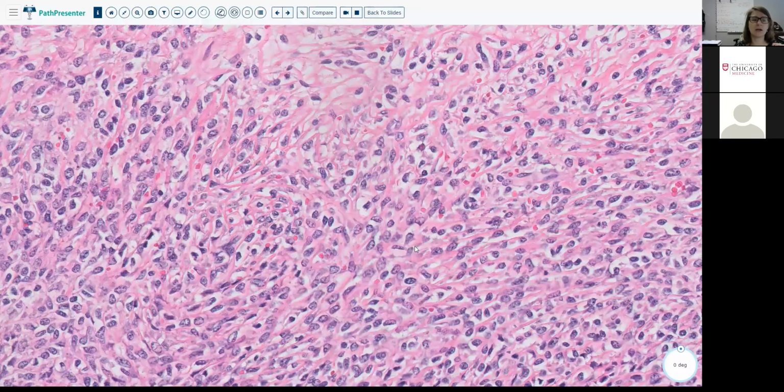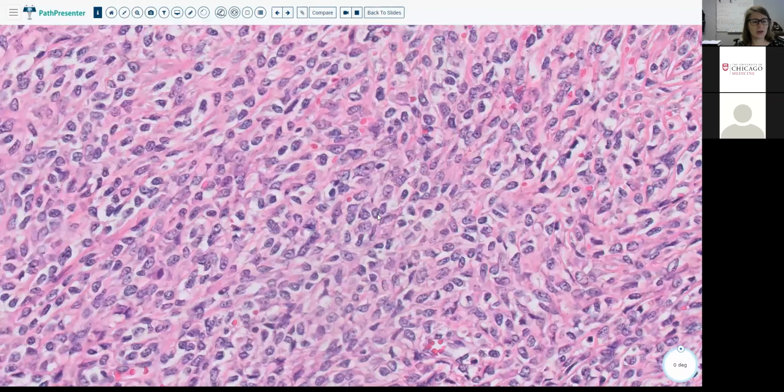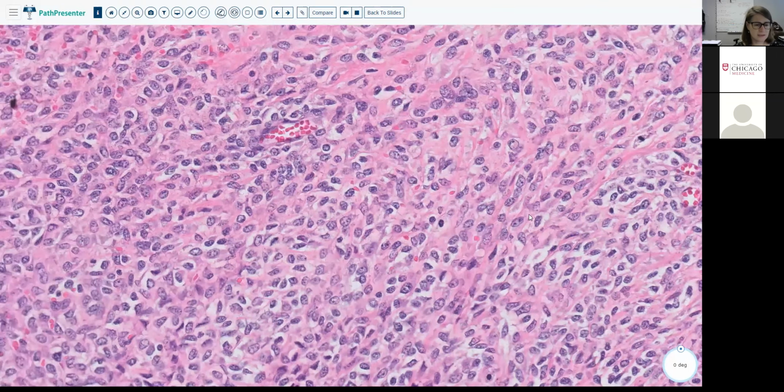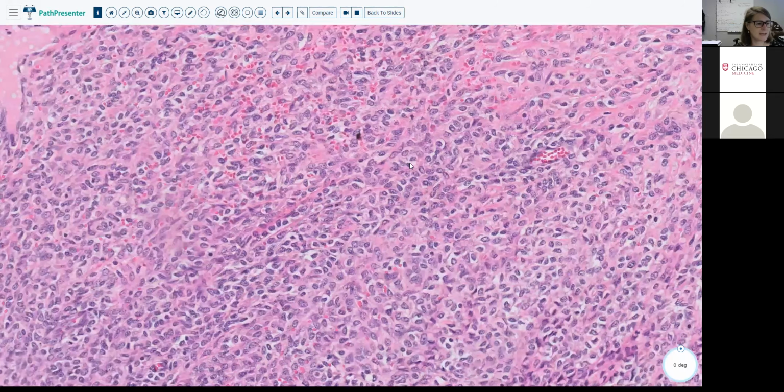A lot of these soft tissue tumors that we're going to be seeing today are sort of plump, rounded, epithelioid in morphology, and the pitfall in a lot of them is that they stain for EMA and or keratins. So just remember that if a soft tissue sarcoma is going to stain for an EMA or a keratin, it's going to tend to be of epithelioid morphology. Maybe something about its differentiation to produce cytokeratins makes it plumper. I don't know, but it fits. So this does express EMA, and it does have these collagenous bands, but it's not synovial and it's not SFT.